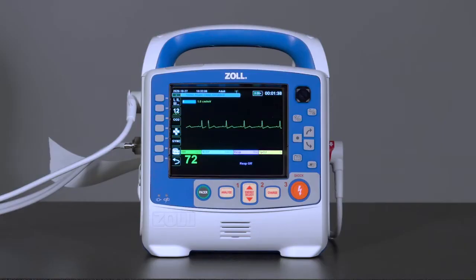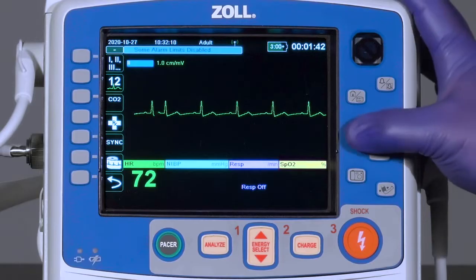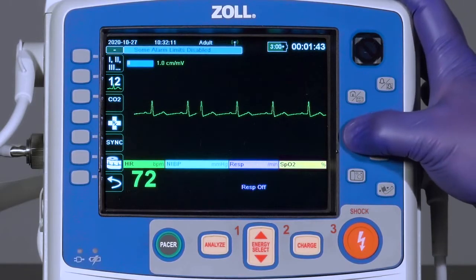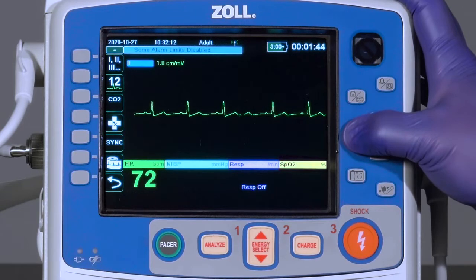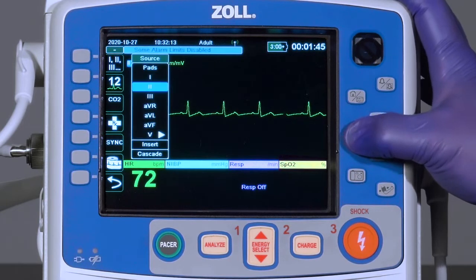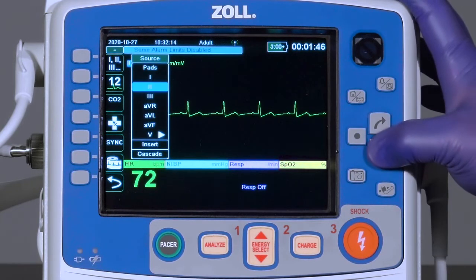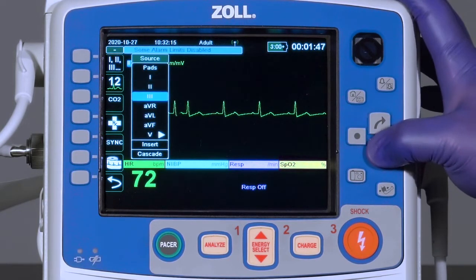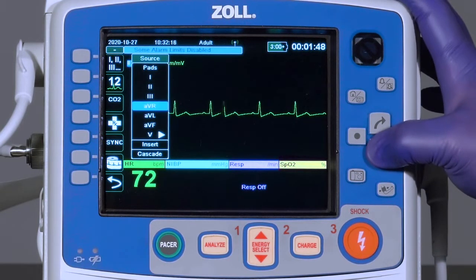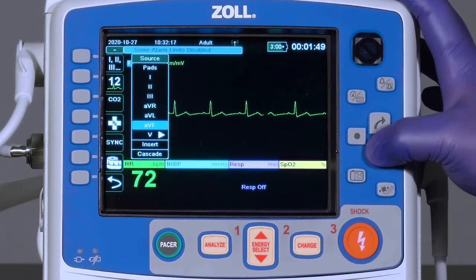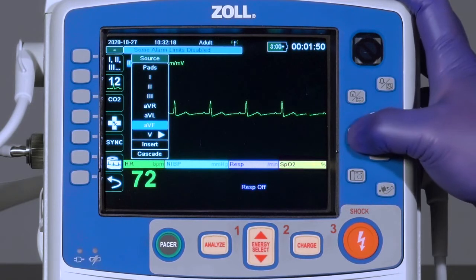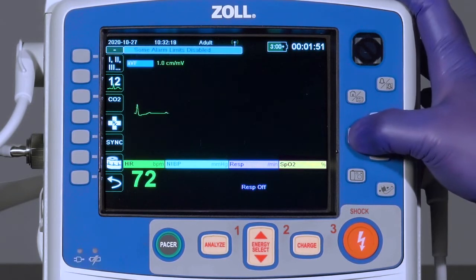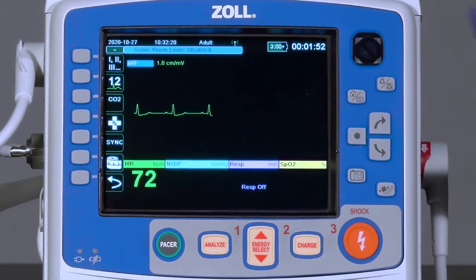An optional way to change lead view is to highlight the lead using the navigation keys, pressing the select button, and selecting an alternate lead view from the drop-down list of available lead views.